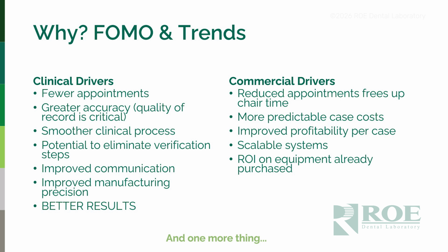But why are dentists and why are practices looking at the digital workflow arch? Well, a lot of it's to do with the clinical side, where we want to have fewer appointments. That obviously leads to a more efficient process. Ultimately, it can create more accuracy, and therefore we can hopefully reduce the amount of problems that we may have with these types of cases, because accuracy is clearly important, creating a smoother clinical process, trying to eliminate that verification step.